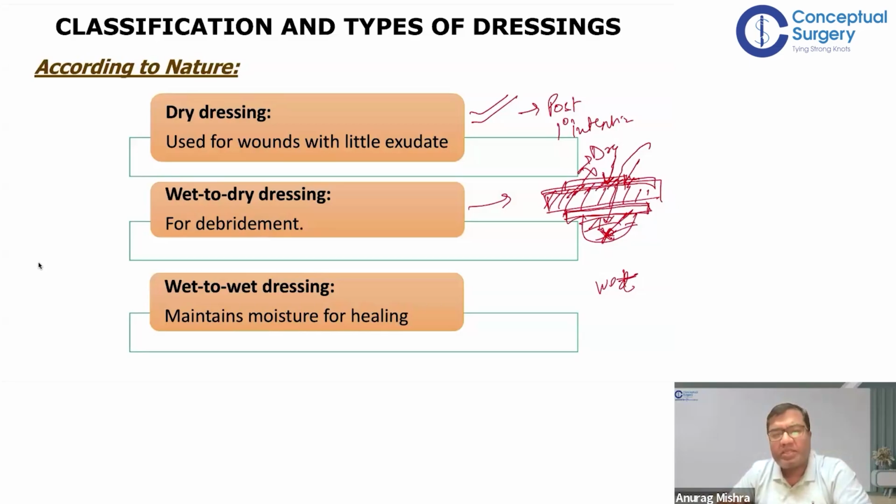Then sometimes, depending on the tissue, for example if bowel is exposed, we do not want a dry dressing at the contact site. It is even more important. So then it is called wet dressings. In some sites only, moisture is required. Some tissues are not supposed to be exposed to the outside, like bowel, like bladder, and so on. So then we have to do moist dressings. Whereas if muscle, skin, or a dressing wound are there, that's okay. It can be slightly less moist.